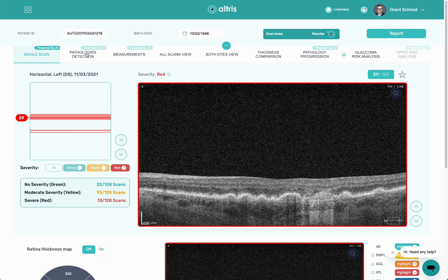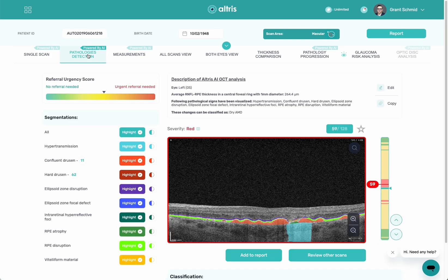From this point I can come over to the next tab, which is pathology detection. Pathology detection has a lot of information for you. The first thing is this referral urgency score — this can be turned on or off. If you want to use it, you can; if not, you can go into your settings and disable it. The referral urgency score works on a weighted average. It takes all the pathology and biomarkers it identifies and those are given a score. For example, a floater might be a one and a detached retina might be a nine, and it takes an average of that to determine if a referral is needed.